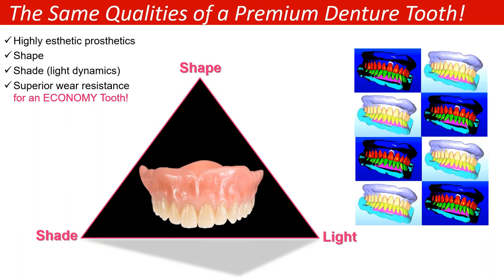So I would advise not necessarily to use this tooth for an implant case unless it's going to be an interim, like an all-on-4 short-term denture base. This could work so that they can help establish a new centric, new occlusal table, occlusal scheme, work with that patient, work with that dentist to try to decide really long-term what the function of that denture tooth or denture, whether it's fixed or removable, should be over an implant.